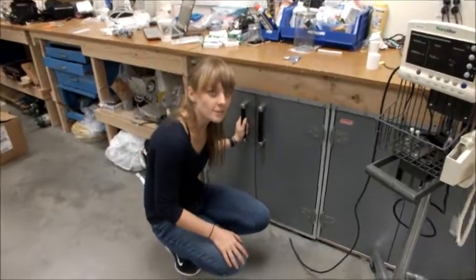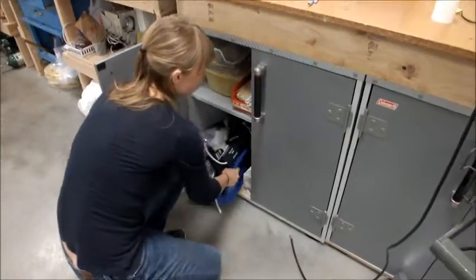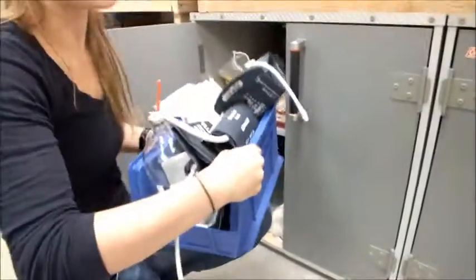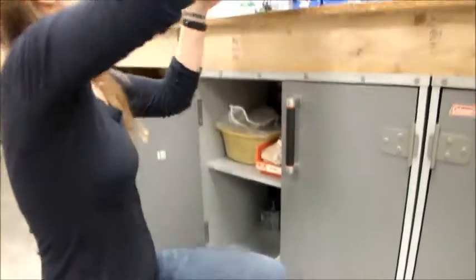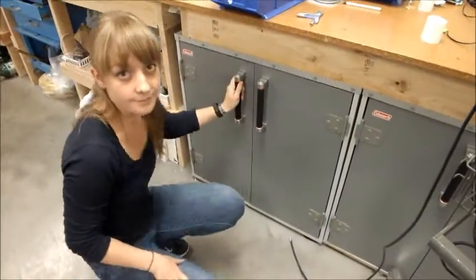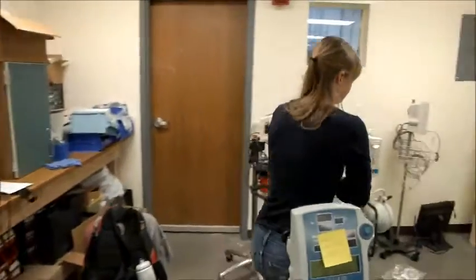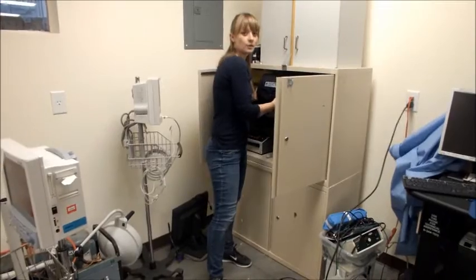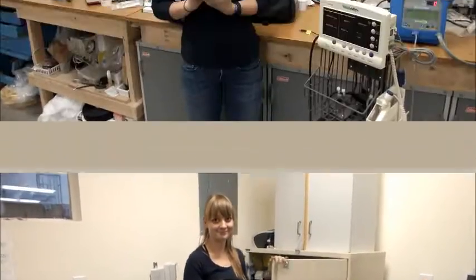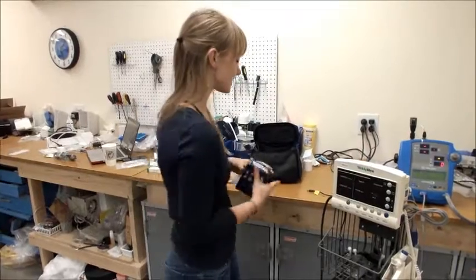We have a few materials we're going to need to gather before we can test our machines. The first thing to look for is a bottle and set of blood pressure cuffs, which will be somewhere in these cabinets — we're going to use these to test blood pressure. Next, we're going to come over to this cabinet here to retrieve the SimCube, which we also need to test blood pressure. The SimCube looks like this — it's got a button on the front and a bunch of indicators for different kinds of blood pressures you can test.